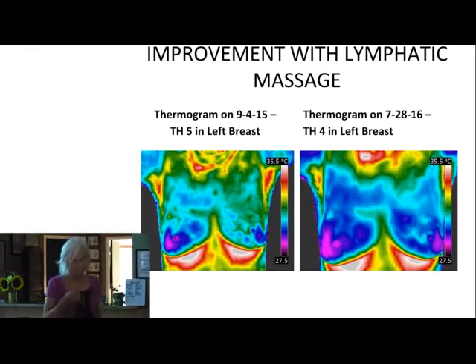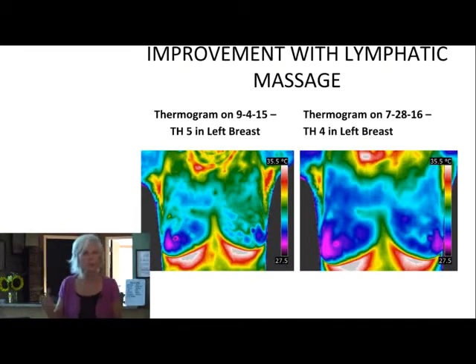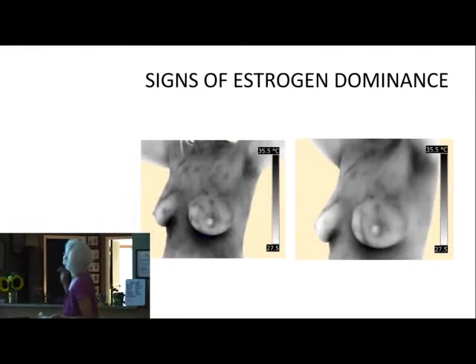So someone at a 2 risk, which is below average, or even 3, you only have to do thermography once a year to make sure your numbers are stable. But with women who are above average, they have to monitor and get feedback from thermography that what they're doing is working. Let's go to the next one, Effie.